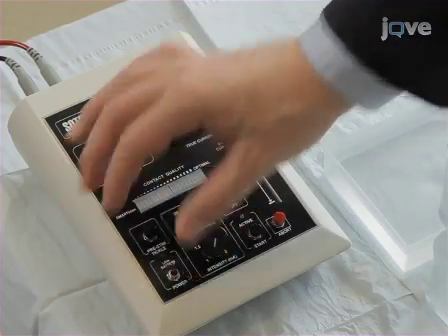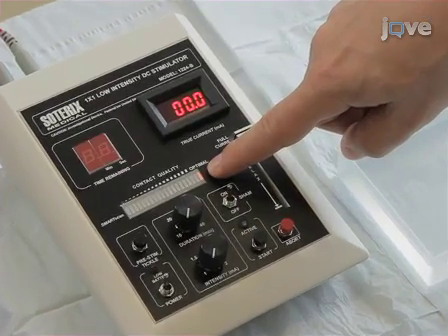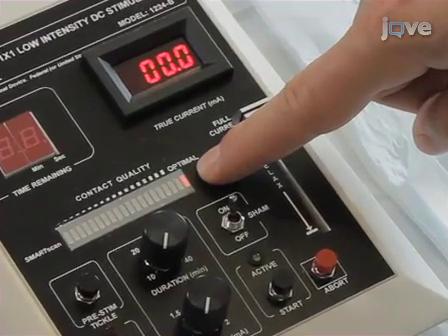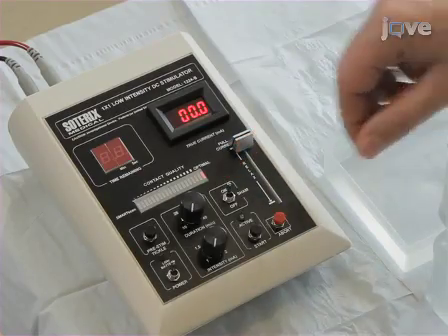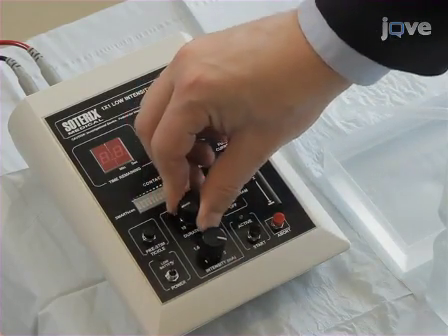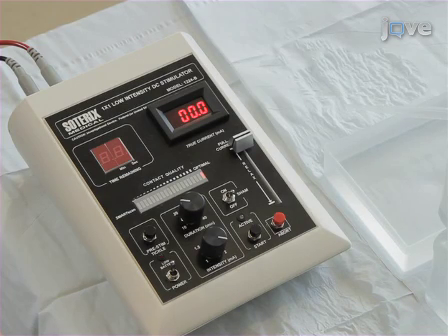Turn on the tDCS device. Use your system to measure the total resistance, being the sum of the electrodes and body resistance. If the overall resistance is abnormally high, this may indicate improper electrode setup. Ideally, aim to have the impedance under 5 kilohms. Adjust the settings for stimulation, including the intensity, time, and if applicable to your device, the sham condition setting. Here, a reliable setting for pain treatment is used: stimulation at 2.0 milliamps for 20 minutes.